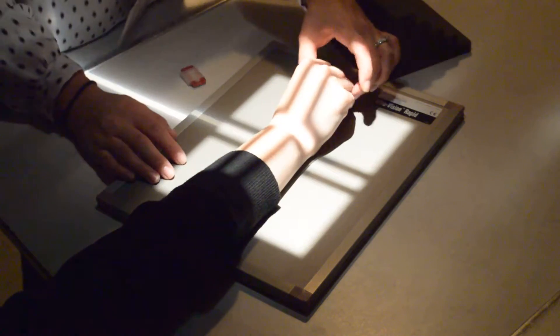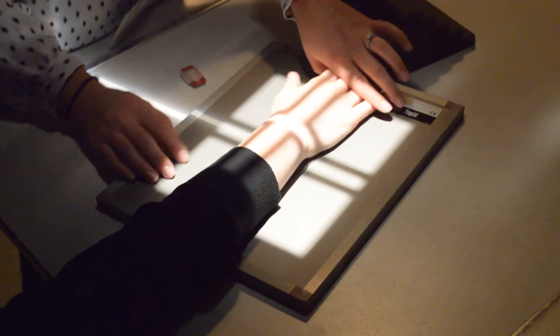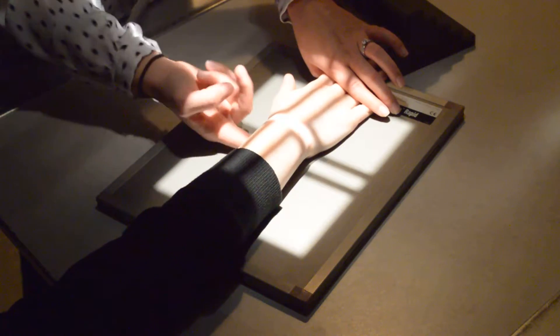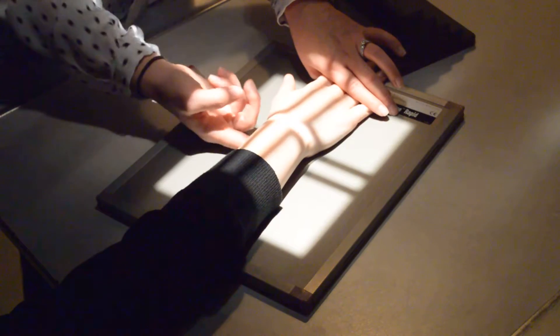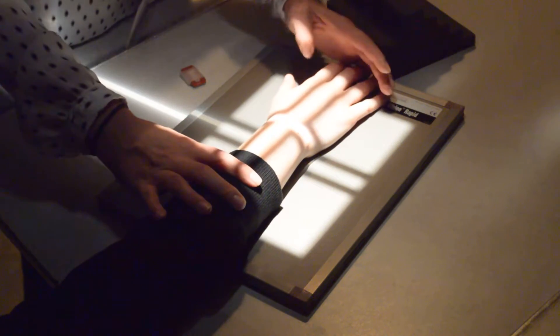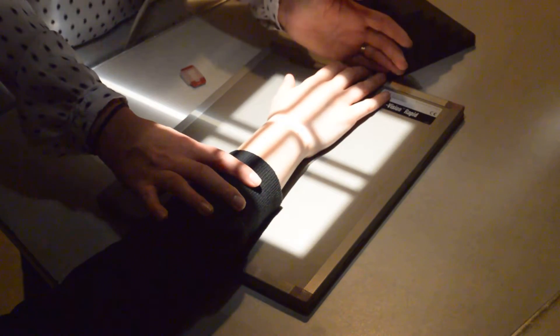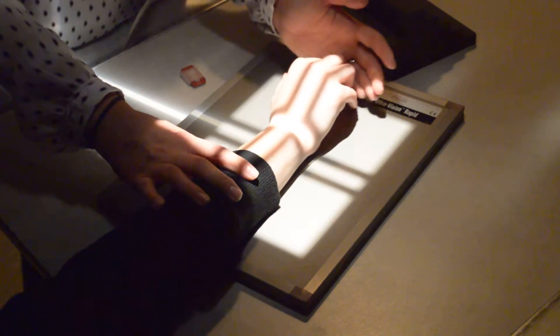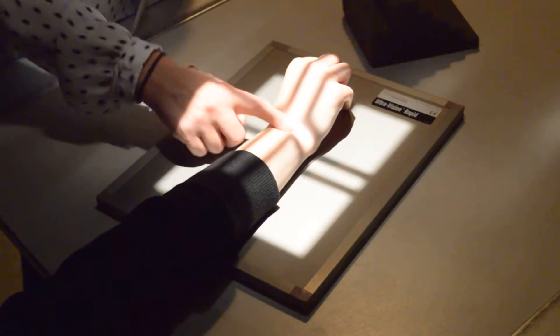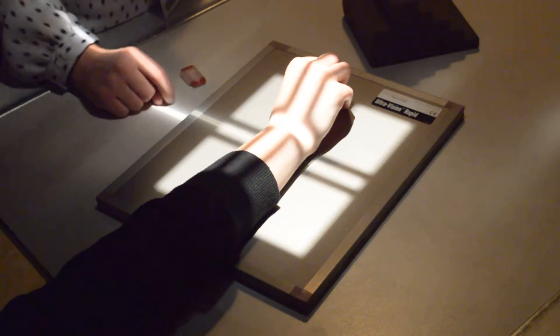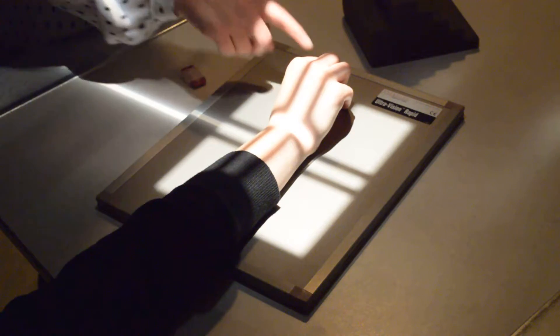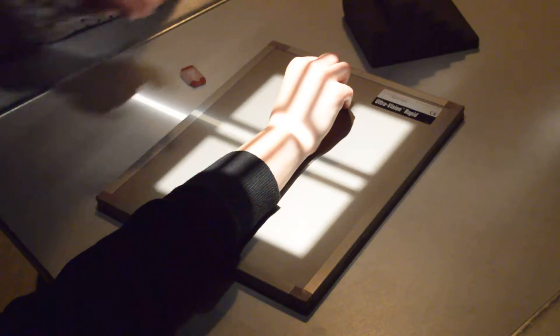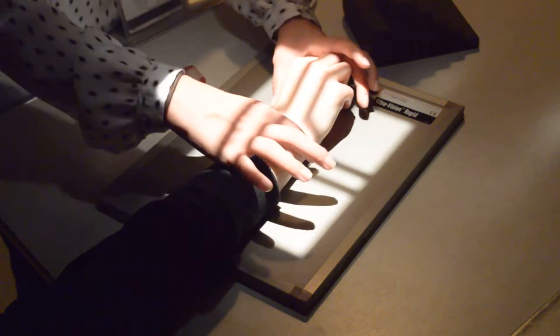Now, you notice when her fingers are relaxed, there's actually space in between the IR and her wrist. As soon as she curls up her fingers and makes a fist, it eliminates all of that OID. So definitely make sure you curl the fingers.